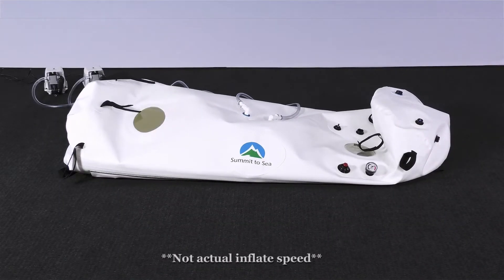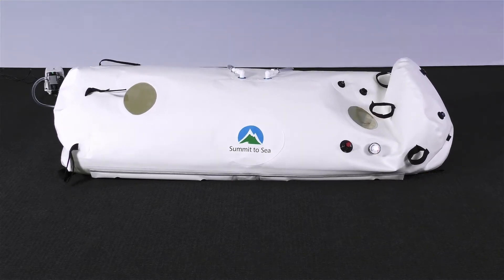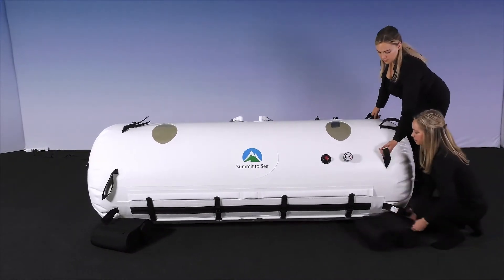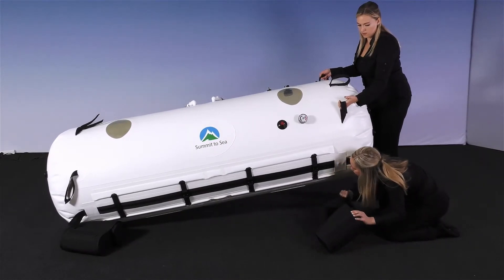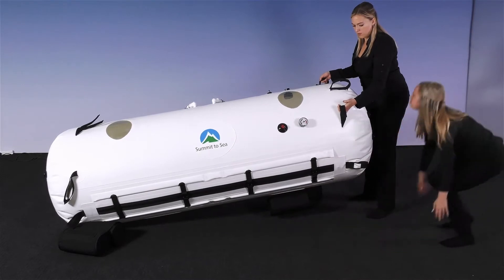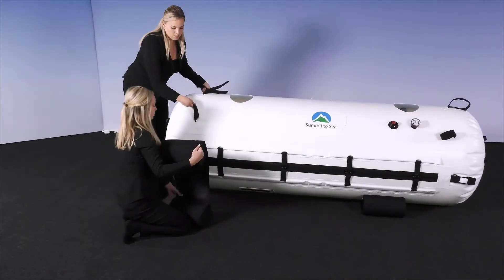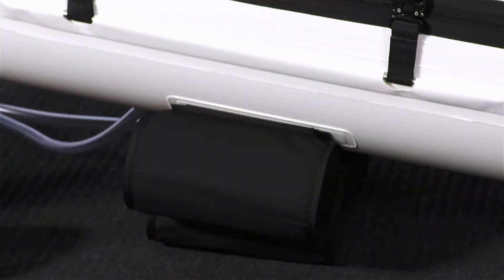Now wait for the chamber to inflate so you can connect the stabilizer cradles and assemble the frame. Once the chamber is to shape, connect the stabilizer cradles to the bottom of the chamber. Lift the chamber one end at a time. Slide in the stabilizer cradles under the chamber and connect them to the velcro patches that are located on the chamber. Make sure that the cradles are aligned correctly with the velcro to ensure that your chamber sits properly.